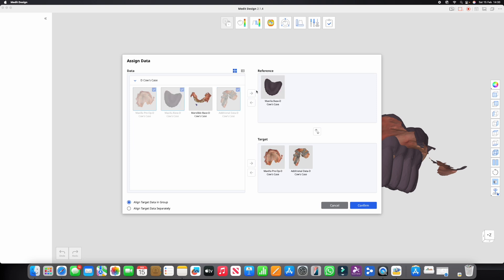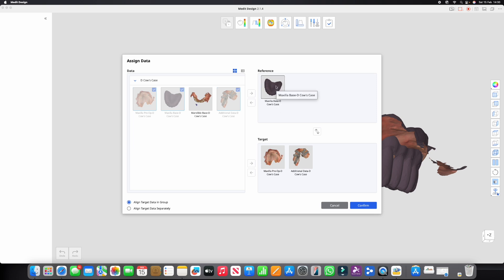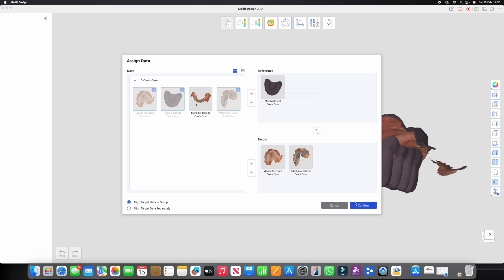That has to stay static because that's where the OVD is. Okay, the occlusal vertical dimension we want to keep the same from the bite that we recorded, so that needs to stay in the exact same place. These two are going to align to that. So I'm going to click confirm and then let's try automatically align data.